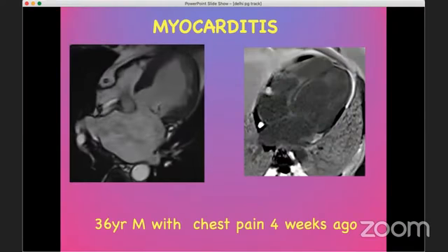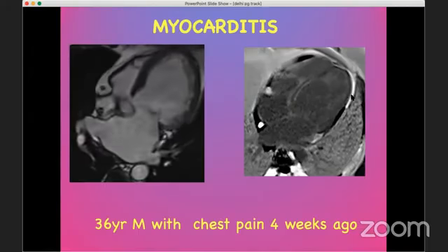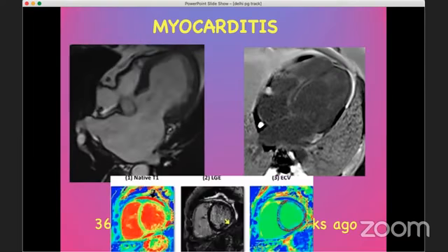And this is a case of myocarditis presented as heart failure. And you can clearly see here the LV dysfunction, the regional wall, which is more global. And you can see the patchy scarring, the pericardial involvement, the pericardial effusion, suggesting that this is a myopericarditis pathology. And these patients will have a very similar presentation as an acute coronary event with chest pain, ECG changes. However, it is very important to distinguish them because the treatment is usually medical, especially with steroids.